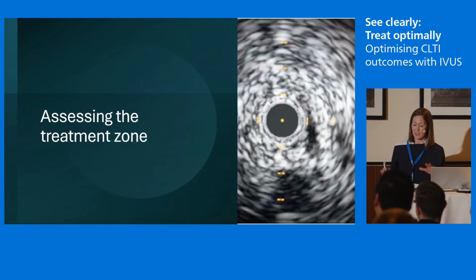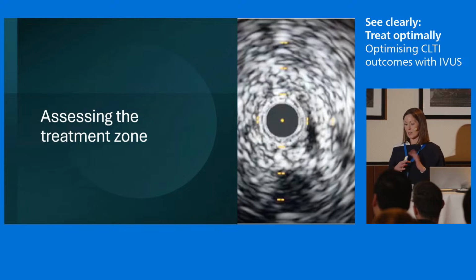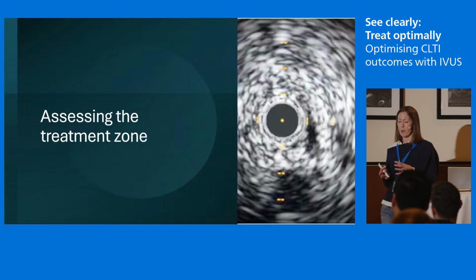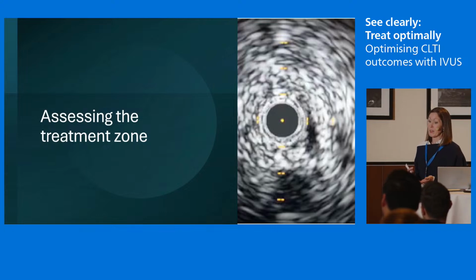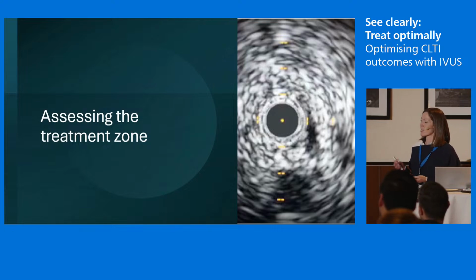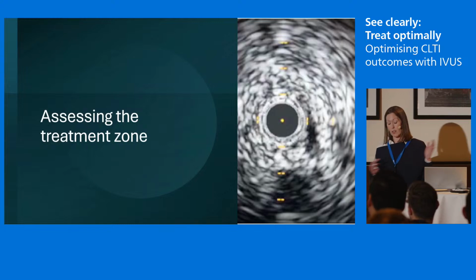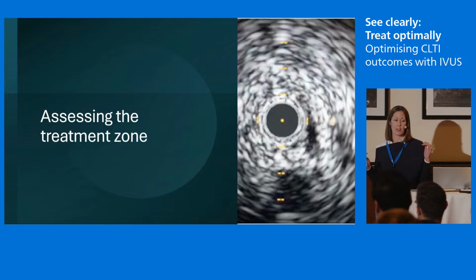He had had a common femoral endarterectomy and iliac stents previously. He then had circumferential necrotic deep ulceration and rest pain. This guy's only in his early 60s, but just didn't have the tissue quality to even contemplate doing any distal bypass. So we were doing a very long, full-length SFA-pop calcified occlusion.